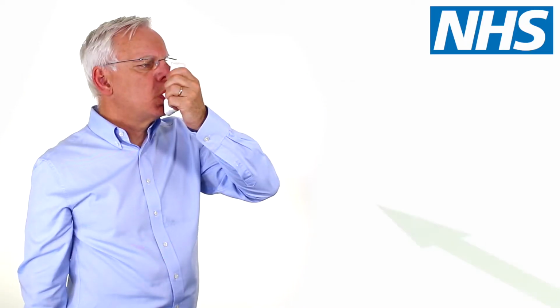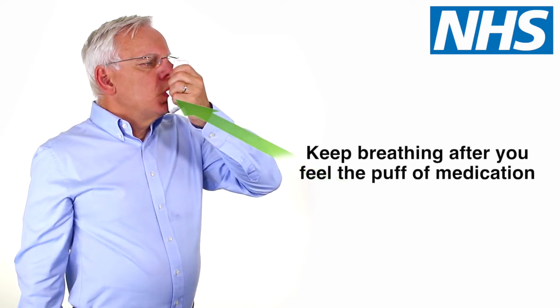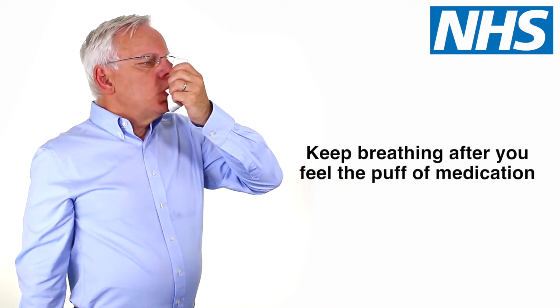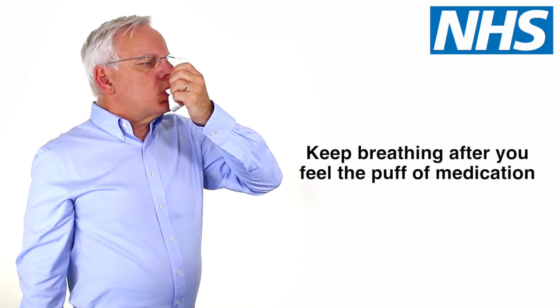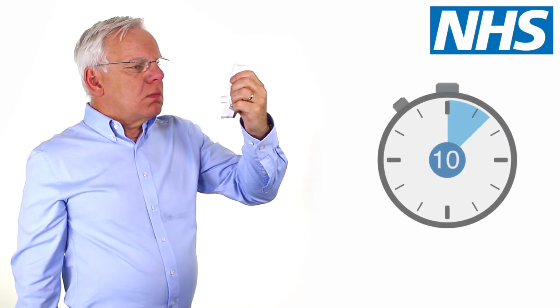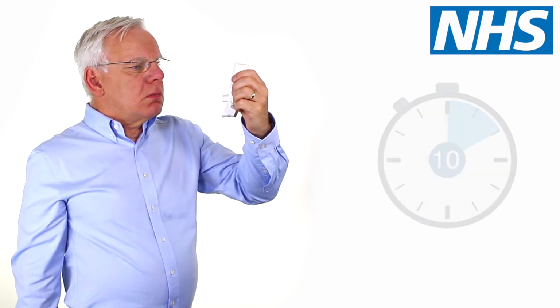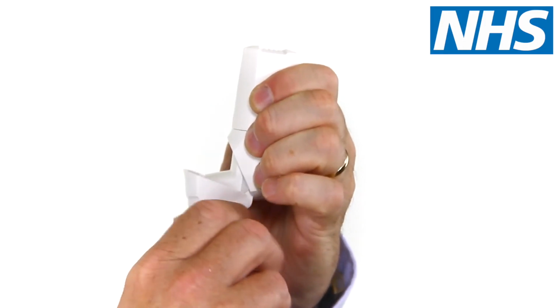Now breathe in through your mouth, slowly and deeply. You'll feel a puff of medication, but don't stop breathing. Keep breathing in as far as you can. Remove the inhaler from your mouth while holding your breath for up to 10 seconds, or for as long as is comfortable. Now breathe out slowly and immediately close the cap over the mouthpiece.